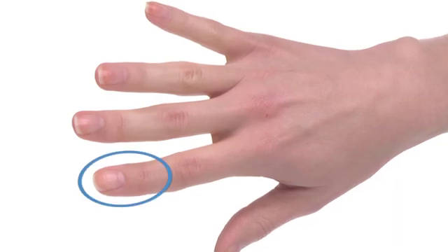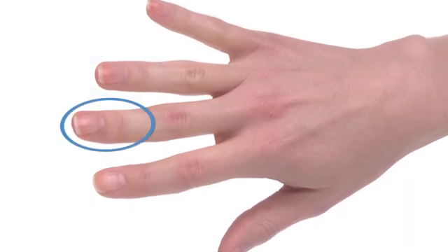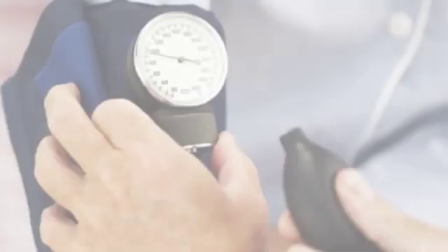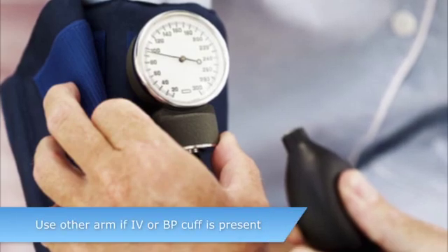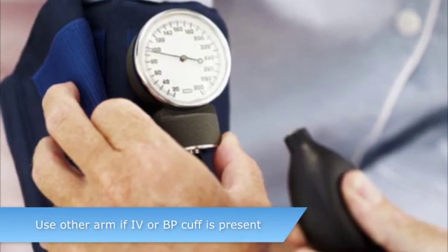The sensor may be placed on the index, ring, or middle finger. If there is an IV or BP cuff on one arm, use the other arm and fingers for sensor placement.